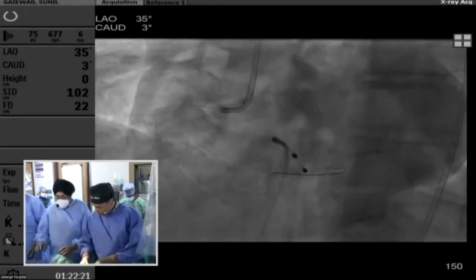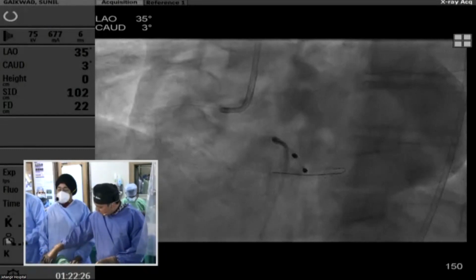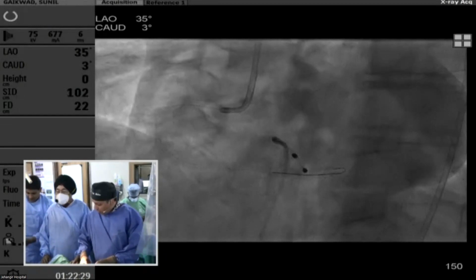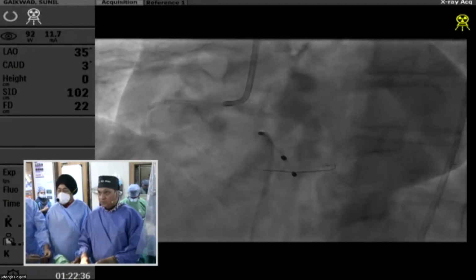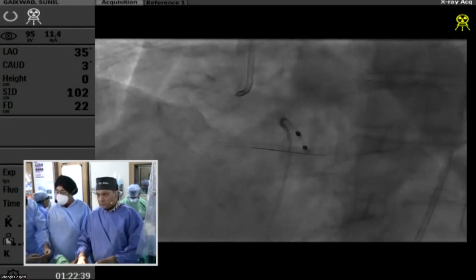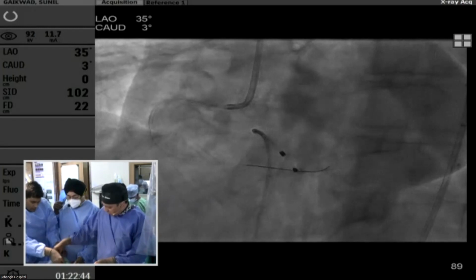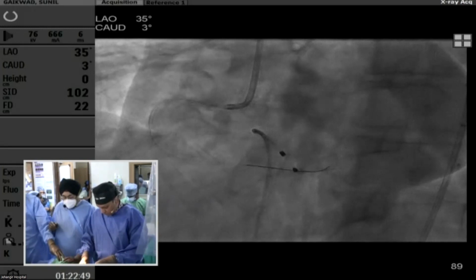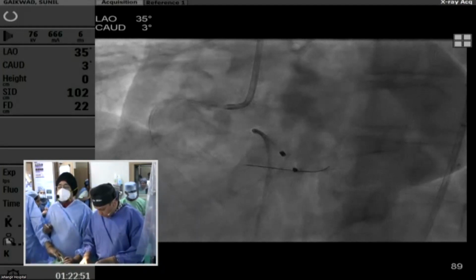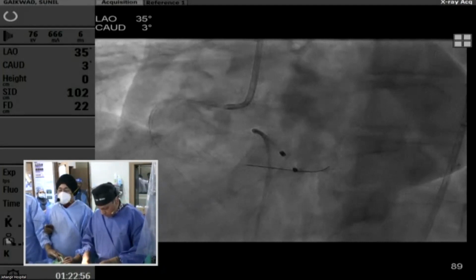He was having angina. Yeah, that was the reason. And I would have loved to see his left coronaries before we started discussing this case, because that would be important. If there are very critical lesions on the left side, we could ultimately get into a slow flow or a no flow situation with such a huge RCA. I would be very apprehensive to do it with such a thrombus. Absolutely correct, but the left side is very important to see in such cases. We'll show you the left side, but if you have shots, we would love to see them.